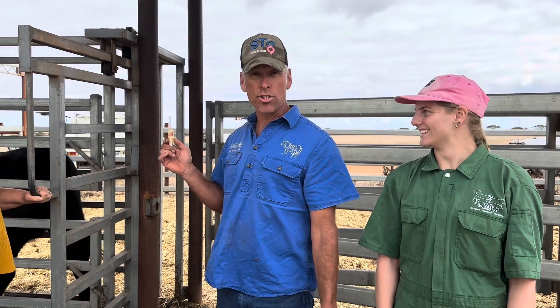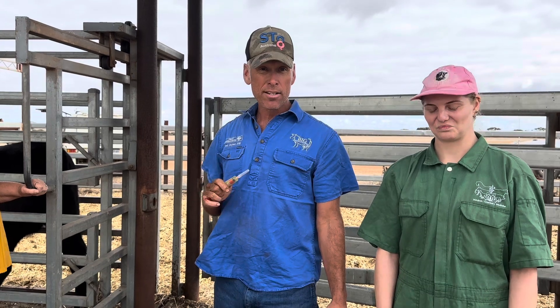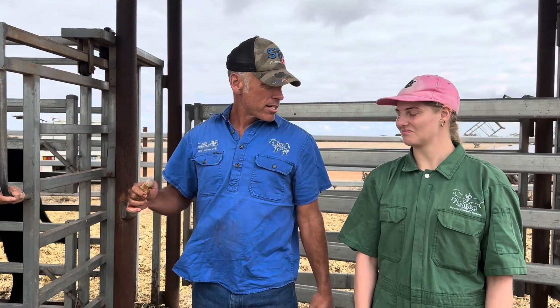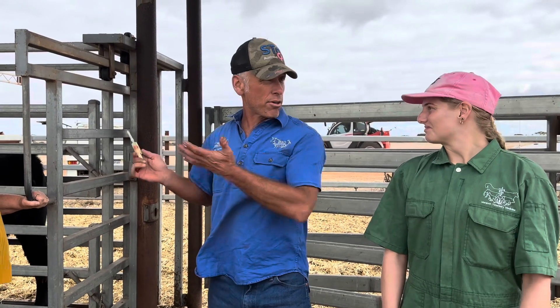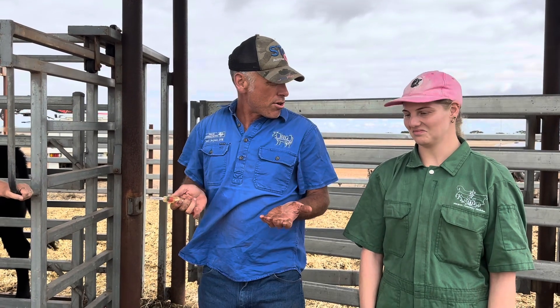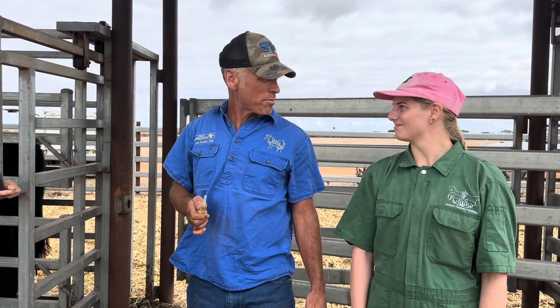What we're doing is blood testing these heifers to see if they've been exposed to a PI — BVD. So if they've been exposed to a PI, they're going to have antibodies. PIs are really good at what they do, so if we blood test a handful of these girls in this population and they're all antibody negative, then we know there's no PI in them. So if they've got no exposure, what could we do to help them?